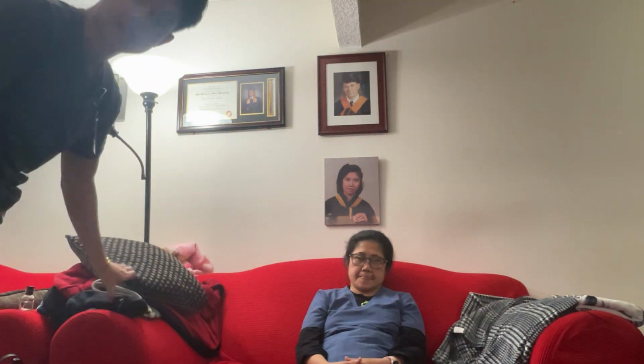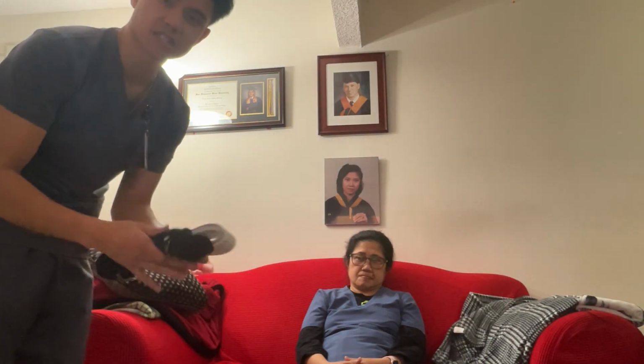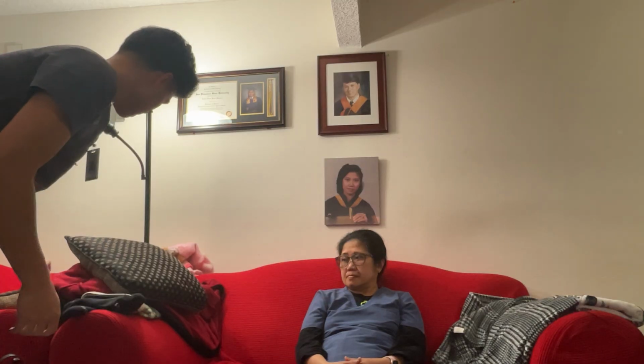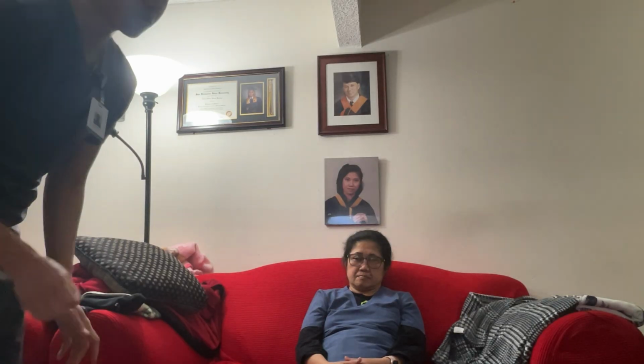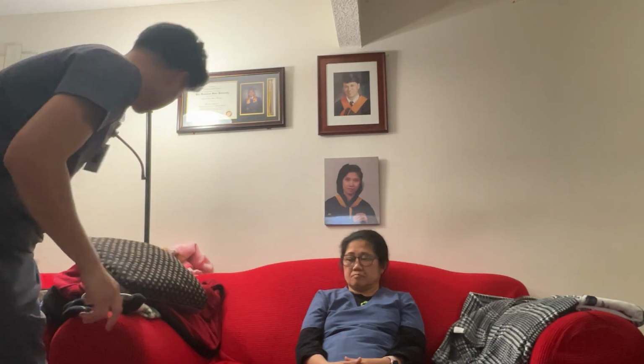And to start off with our supplies, we have here our Gait Belt and non-slip socks that we'll be using for this skills. And we also have hand sanitizer for hand hygiene. Alright, to start off, I would open and close the door behind me to ensure proper patient privacy. And then I would perform some hand hygiene to show the patient that we're staying clean.